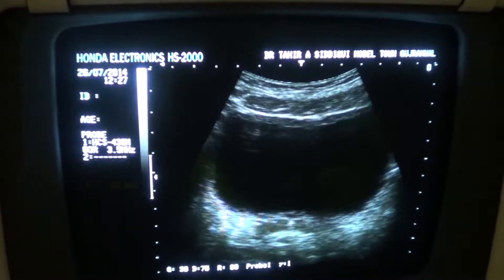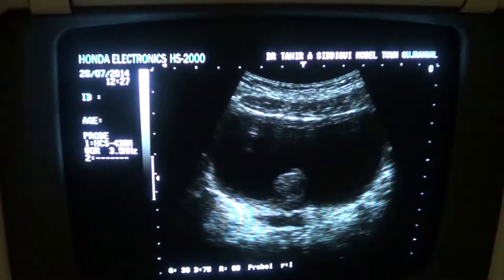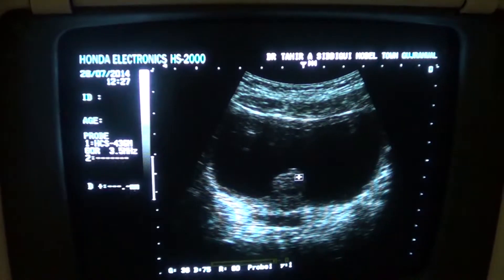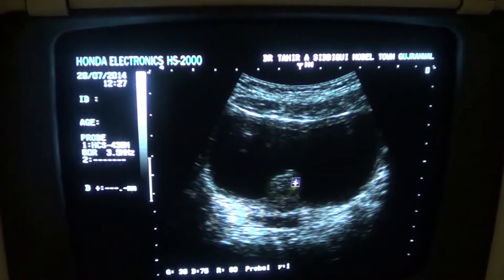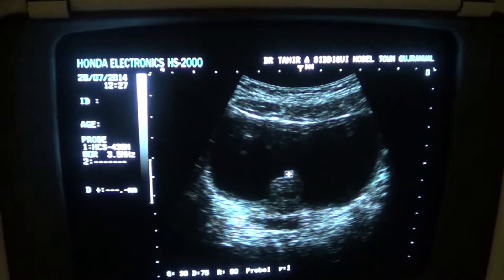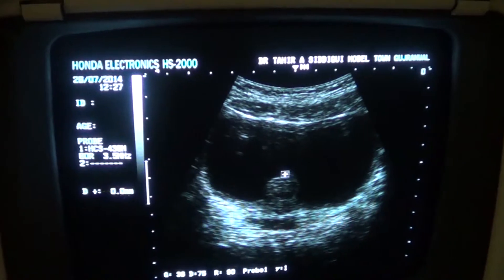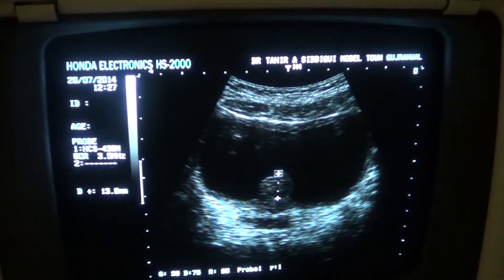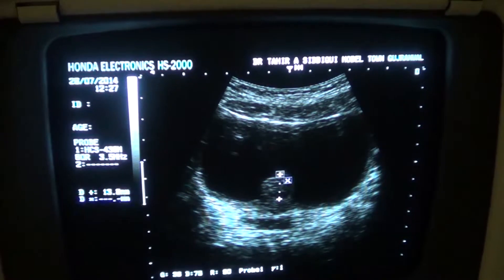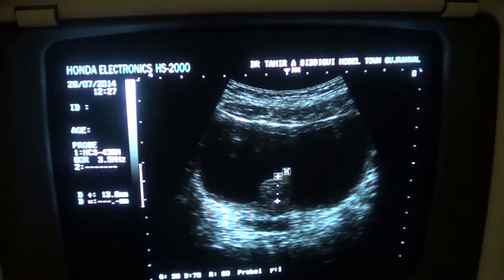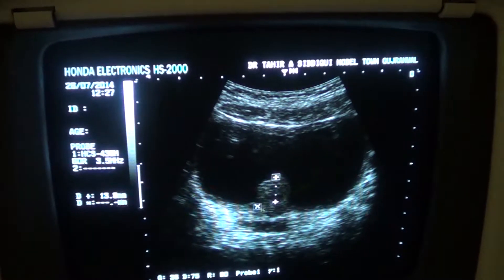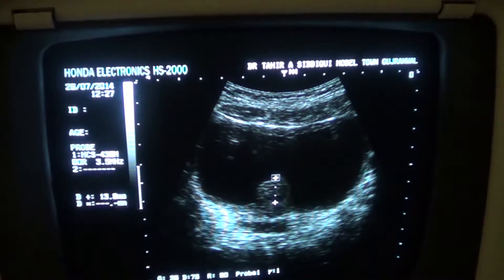This is the transverse section, and in transverse section you can again see a globular area which is the median lobe, approximately 13.8 mm, protruding into the posterior wall of the urinary bladder. This is the enlarged median lobe of the prostate.